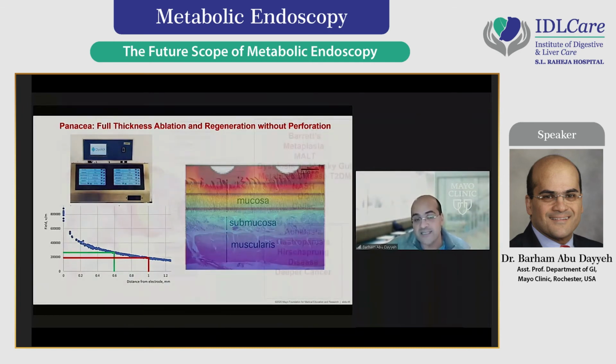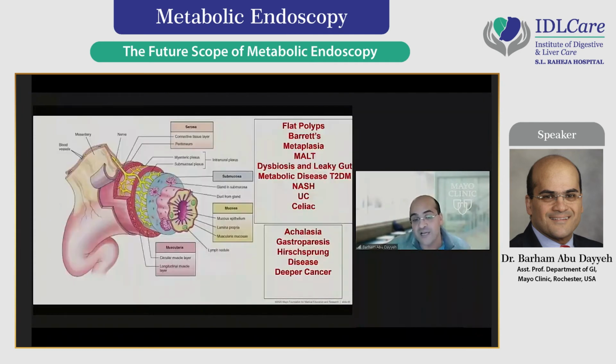So you could see the advent of non-thermal ablation that could ablate the entire lumen could be applicable to multiple mucosal-based diseases like Barrett's, early cancer, NASH, ulcerative colitis, but also into muscular-based diseases like achalasia, gastroparesis, Hirschsprung, and what have you. Very exciting and very novel development in our field to introduce pulsed electrical field as a new athermal energy modality capable of doing lots of things in the GI space.